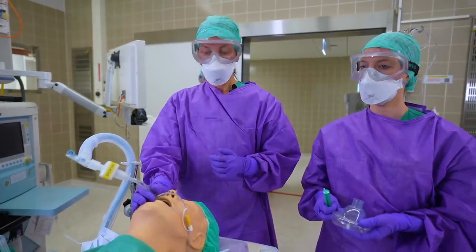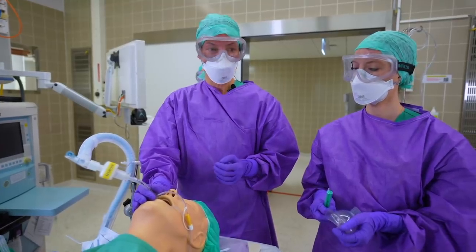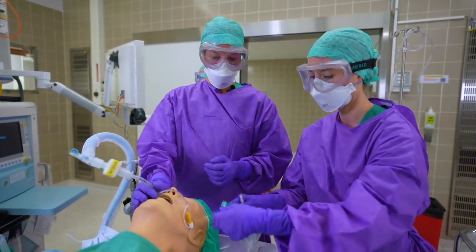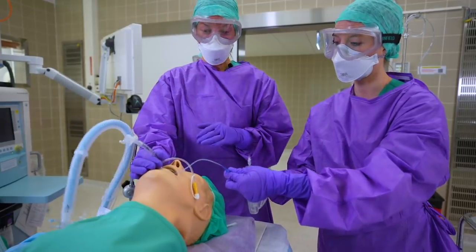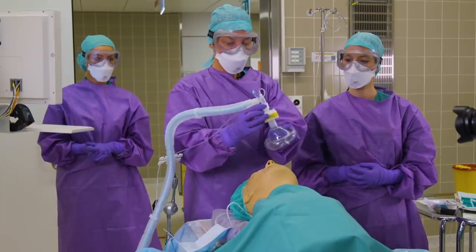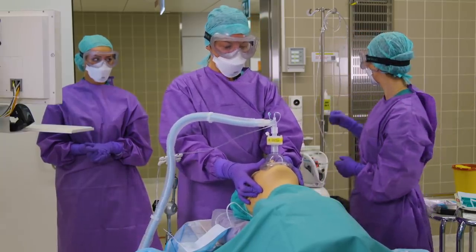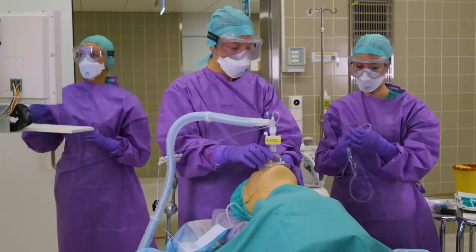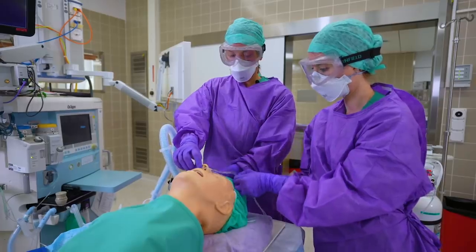It is important to avoid coughing when you extubate the patient. IV lidocaine or remifentanil come in handy. When you extubate, you are not utilizing positive pressure, but rather you are deflating the cuff and pulling the tube. We dispose of the tube right away and oxygenate the patient with a tight-fitting mask. Once the patient is adequately breathing, we are utilizing nasal prongs for transport. After the nasal prongs are on, the patient will also receive a surgical face mask.